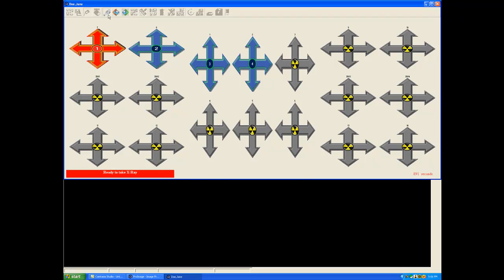Now, you actually don't have to hit the stop button. If you do the entire sequence, when you finish with the fourth and last shot, it will automatically go back to review mode, and you will see all of your thumbnails displayed here.